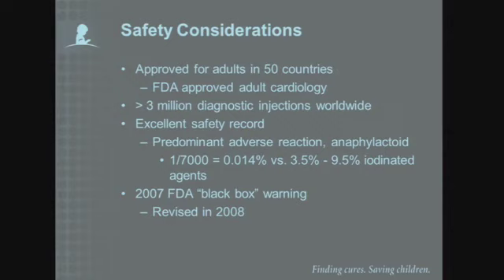So I want to spend some time discussing the safety considerations associated with these contrast agents, because I think that this has been one of the barriers to their widespread use in our country. These contrast agents have been approved for adult use in 50 countries worldwide. Currently in the United States, they are FDA approved only for use in adult cardiology patients. However, there have been over 3 million diagnostic injections of these contrast agents given worldwide, and they have been shown to have an excellent safety record.